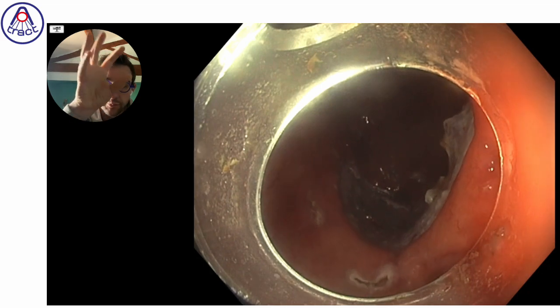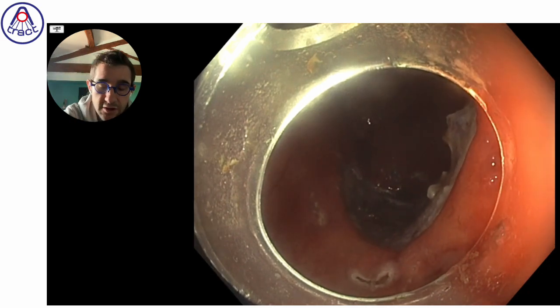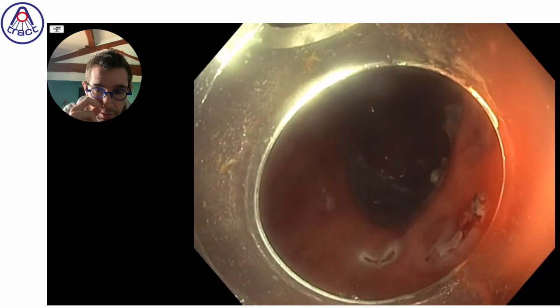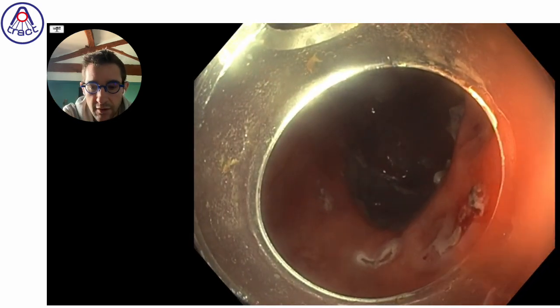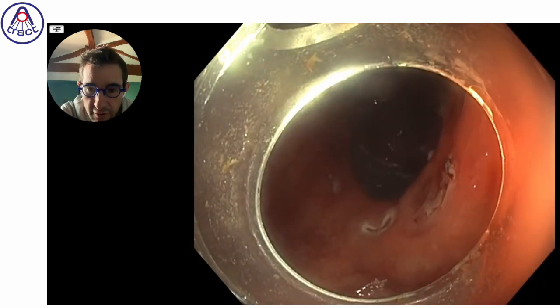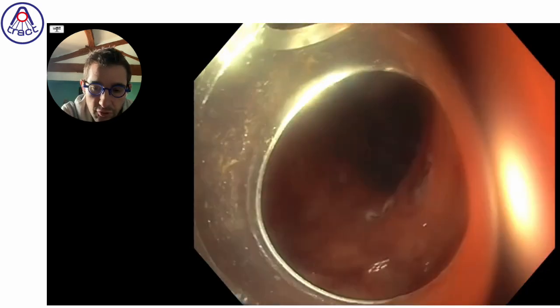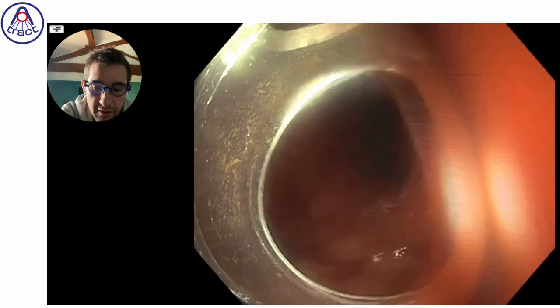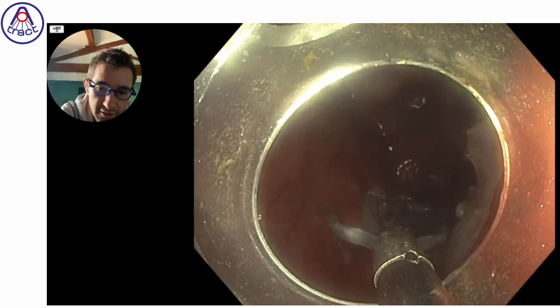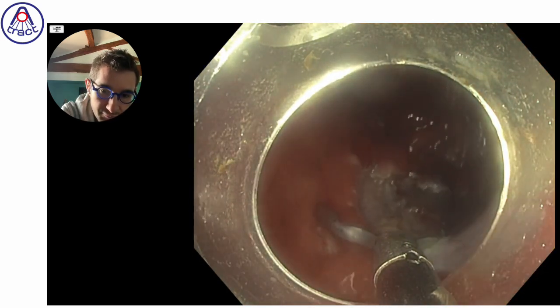the colon, because all the points of traction are pulling the lesion into a kind of small umbrella, like a wallet closed on itself, easier to bring back while descending the colonoscope.